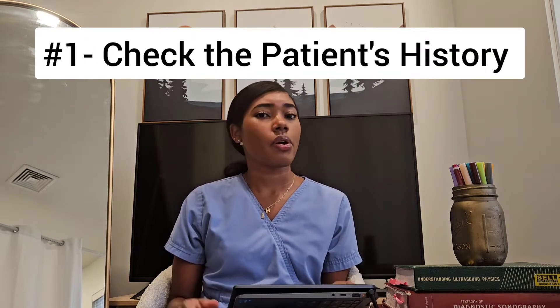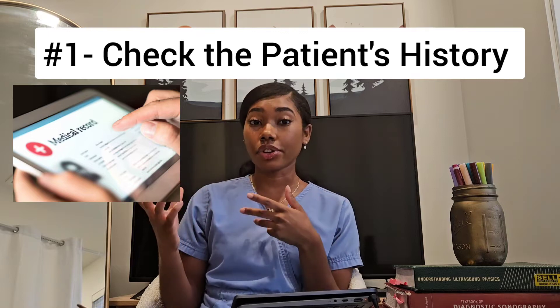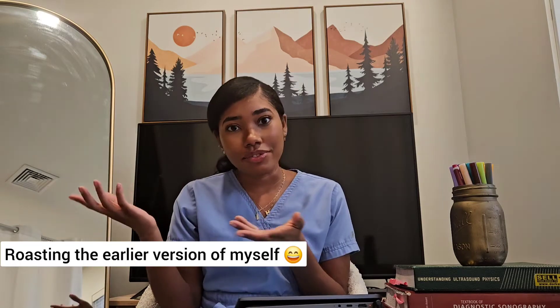Number one: check the patient's history. What exams have they had performed recently? Do they have other imaging that has demonstrated some pathology already? Because sometimes if you skip this part and just go straight into scanning, you come across something crazy. But it has already been found and documented — you should have checked the previous exams and then you would have known.